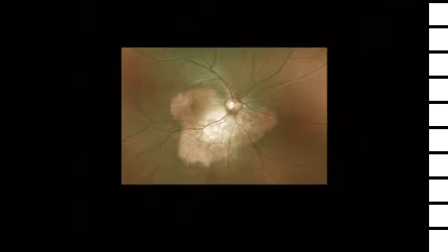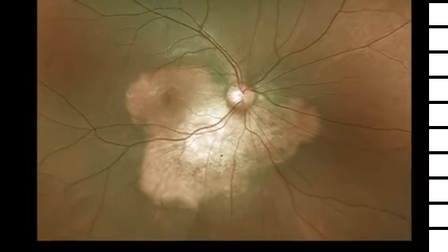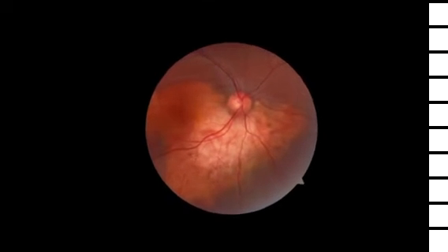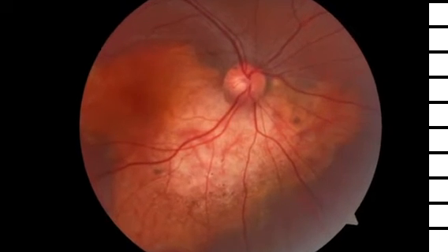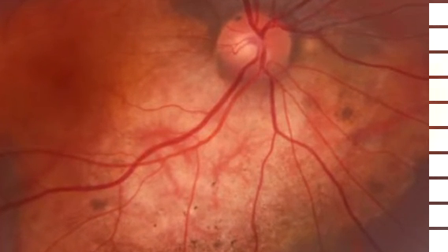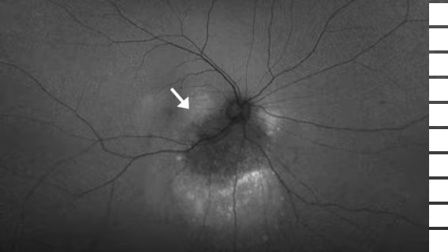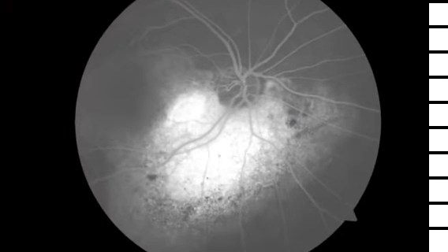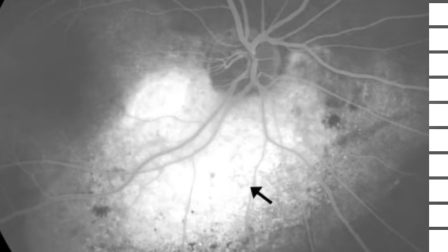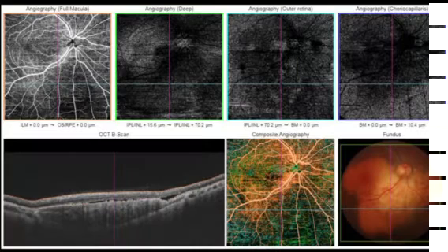Choroidal osteoma is a rare benign ossifying tumor characterized by a mature cancellous bone involving the choroid. On examination, it presents as an orange-red to a pinkish-orange lesion with distinct geographic or scalloped borders with branching vessels on the surface of the tumor in the juxtapapillary and macular areas. Fundus fluorescein angiogram demonstrates a patchy hyperfluorescence in the early phases with staining in the late phase. OCT angiography is important to rule out the presence of a choroidal neovascular network in a choroidal osteoma.